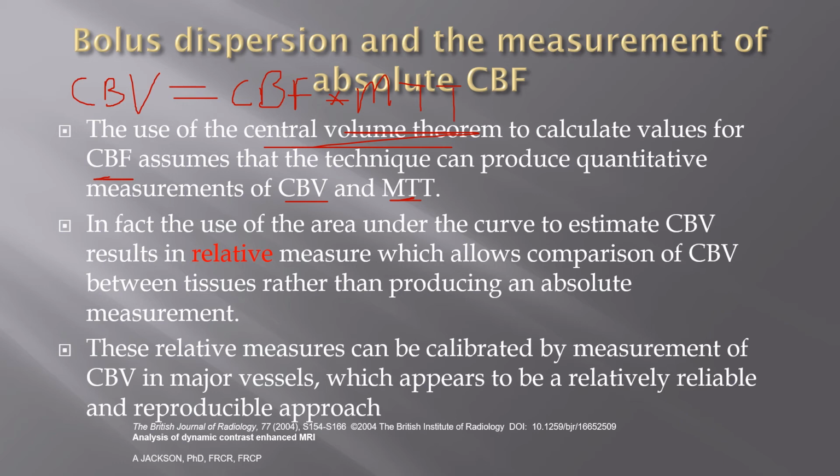Okay, so you get your CBV by looking at that area under the curve. And these are relative measures. You can make them a little less relative by using an arterial input function. Often, to help normalize the data, you use a ratio. You take the ratio of your value within the lesion of interest versus some normal tissue on the other side of the brain. And that ratio helps to correct for all kinds of different errors that can occur, be it different contrast, different magnet strengths, different boluses going through the body. It does help to normalize the data, not perfectly certainly.